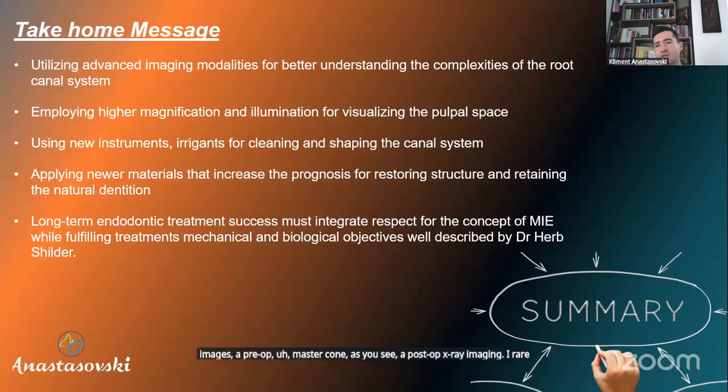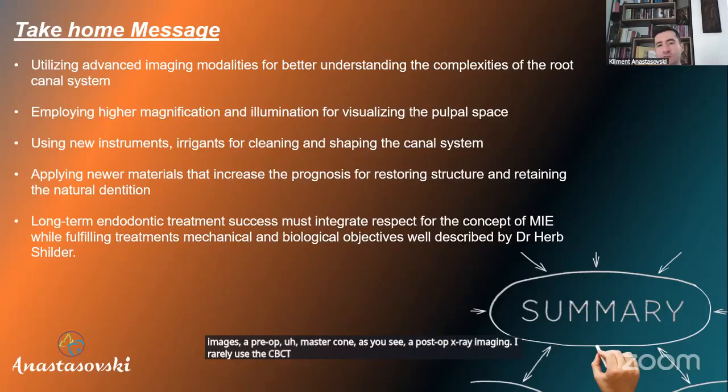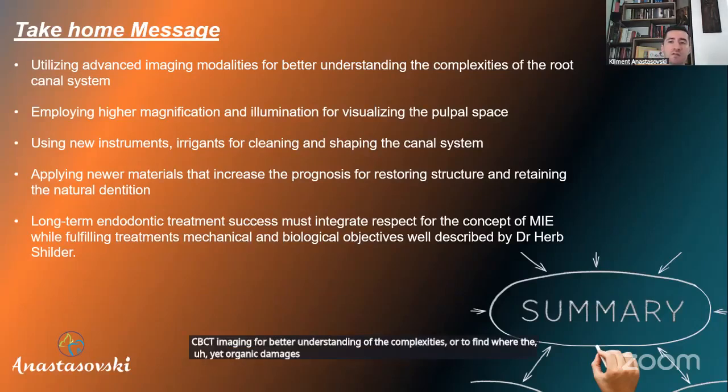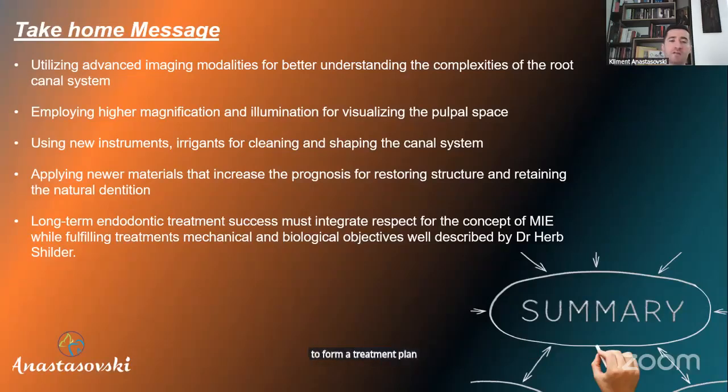I rarely use the CBCT for my initial treatment, but in more of my retreatment cases, I am using CBCT imaging for better understanding of the complexities, or to find where the iatrogenic damages were made in the previous treatment, to form a treatment plan before initiating the root canal retreatment and finish a better job than the previous one.